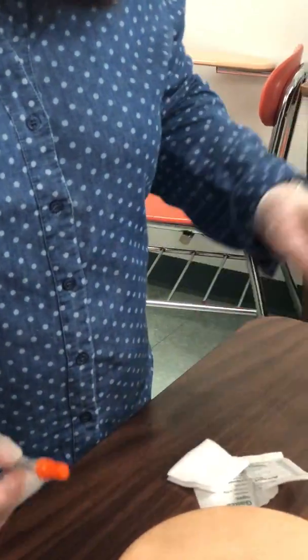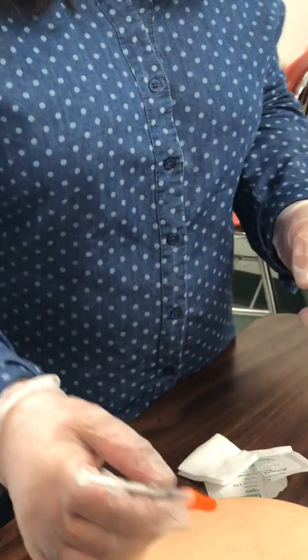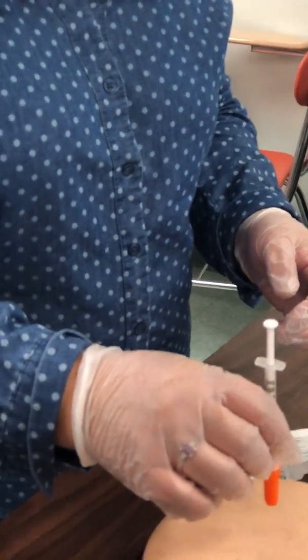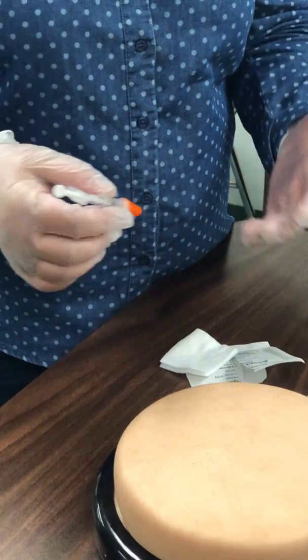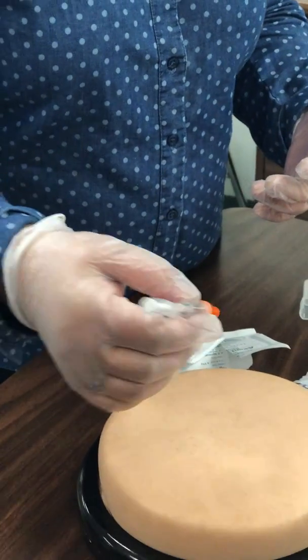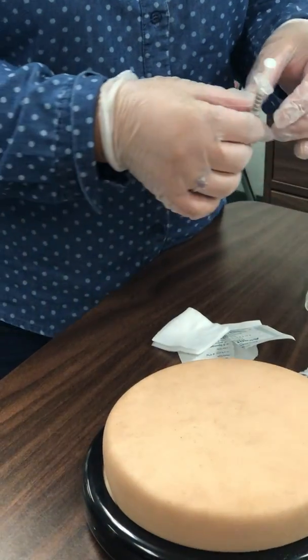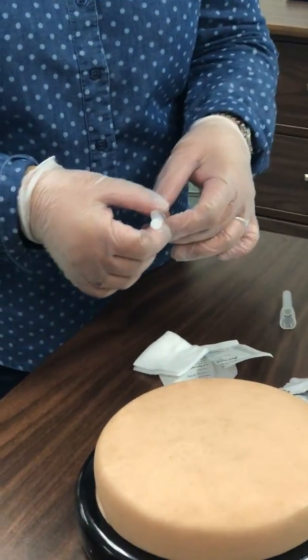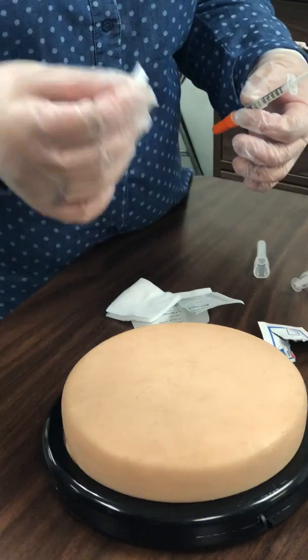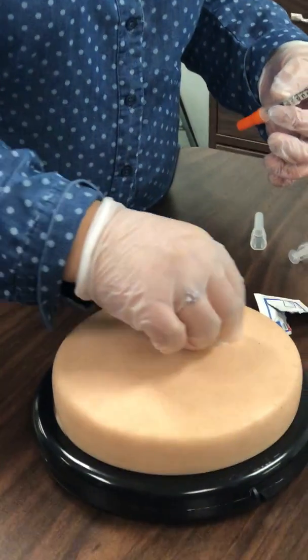All right, so this one, there are 2 ways of injecting the sub-Q, 45 degrees or 90 degrees, all right? But usually during the performance exam, because they want to see your technique on how to go in and out of 45 degrees, they usually ask to do it 45 degrees for sub-Q, all right? Of course, we will pretend this is new. Okay, we will go in, out, all right?